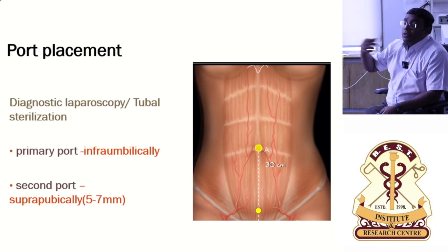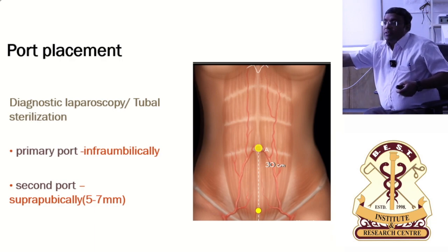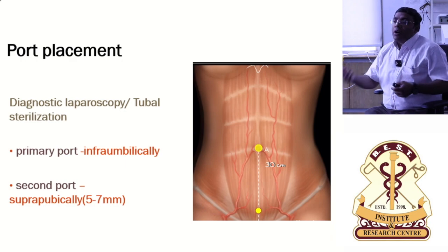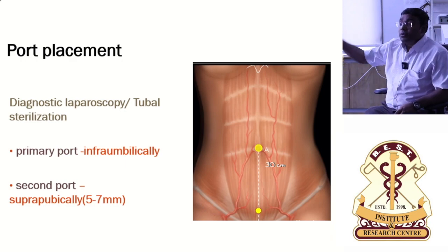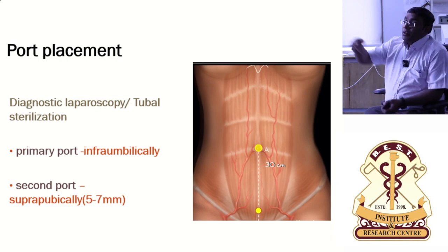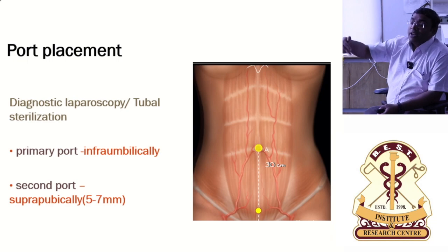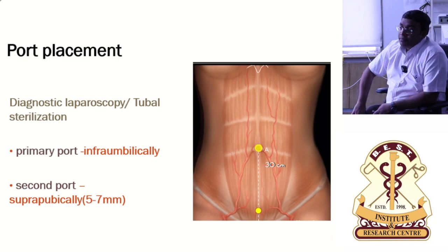If you are tall, you can put one more port on the other side, it's okay. But if you are not tall, or not ready to go to the opposite side to coagulate the uterines, then with the ipsilateral port, coagulation of the uterine vessels on that side is going to be a little challenging on the right side.